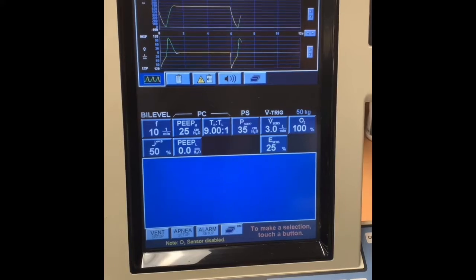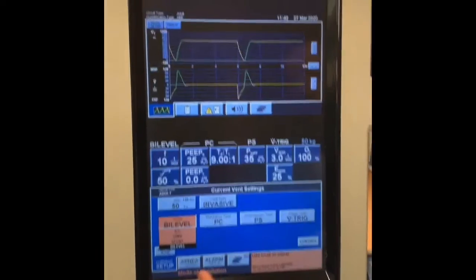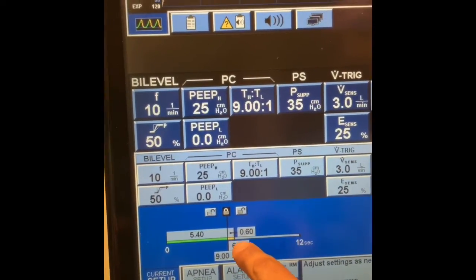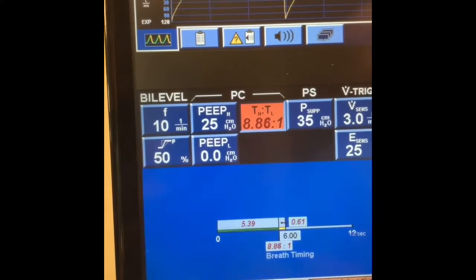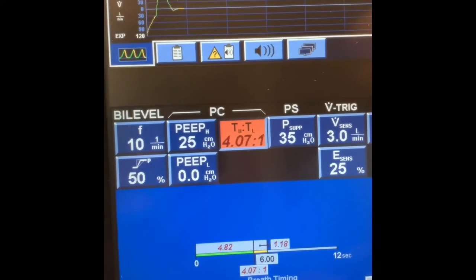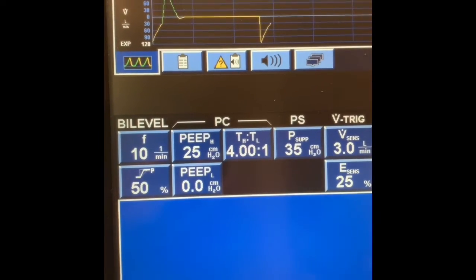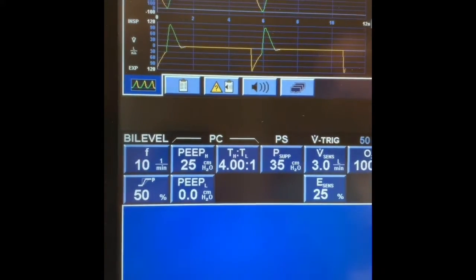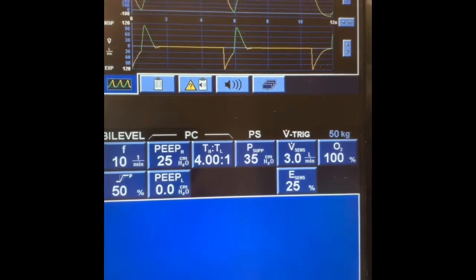Setting up IE ratio — 4 to 1. It's still a total cycle time of 6 seconds. This is a 4 to 1 IE. With P low — at this point, if you want to add P low you can, it's not necessary depending on how fast the patient is breathing. Watch your tidal volumes. You might have to go down on your P high if you're doing lung protective strategies.